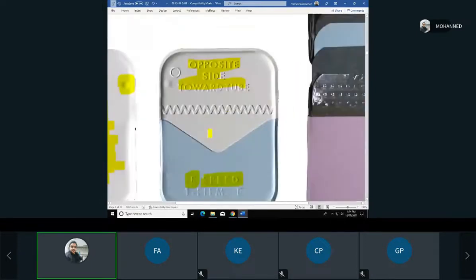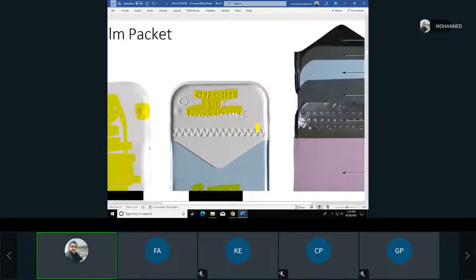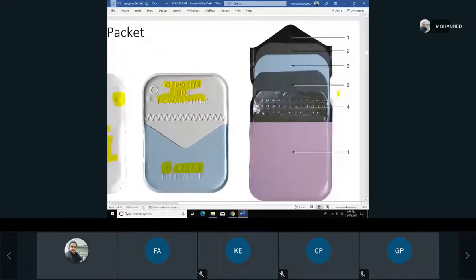And sometimes, instead of putting 1 film, they would put 2 inside, so you can give the patient 1 and keep 1 for your records. They would also note it's a duplicate film. That used to be a problem. You have to duplicate a film for a patient, and we have a duplicator that we duplicate films with. But now with digital, you just send it to them. Anyway, we just need to learn these things to know how much better things are.